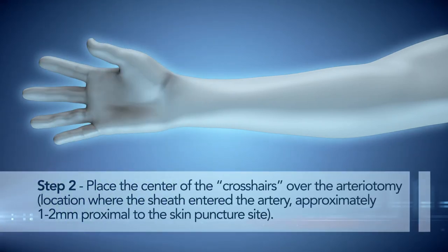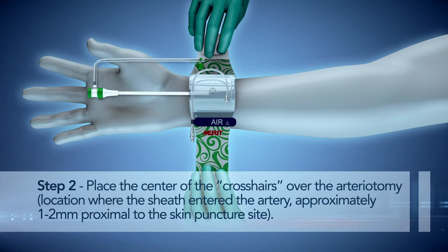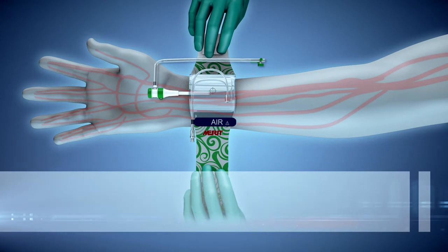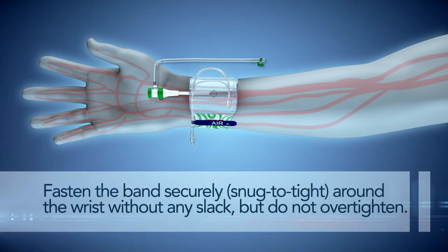Step 2. Place the center of the crosshairs over the arteriotomy — the location where the sheath entered the artery — approximately 1 to 2 mm proximal to the skin puncture site. Fasten the band securely around the wrist without any slack, but do not over-tighten.